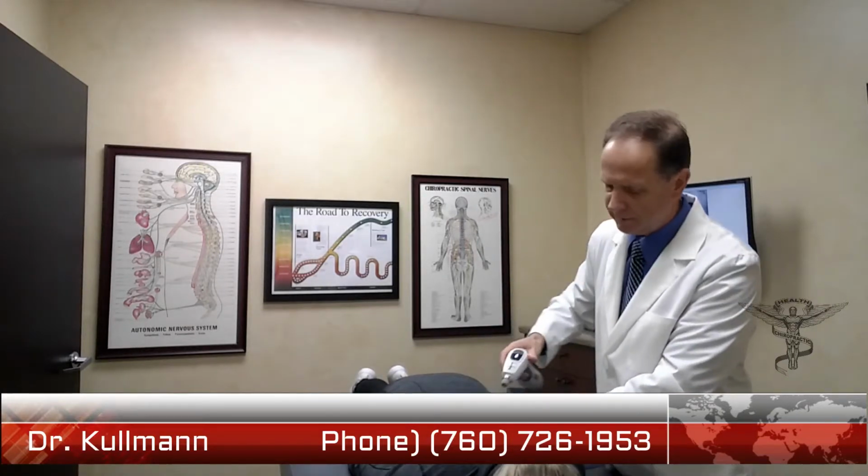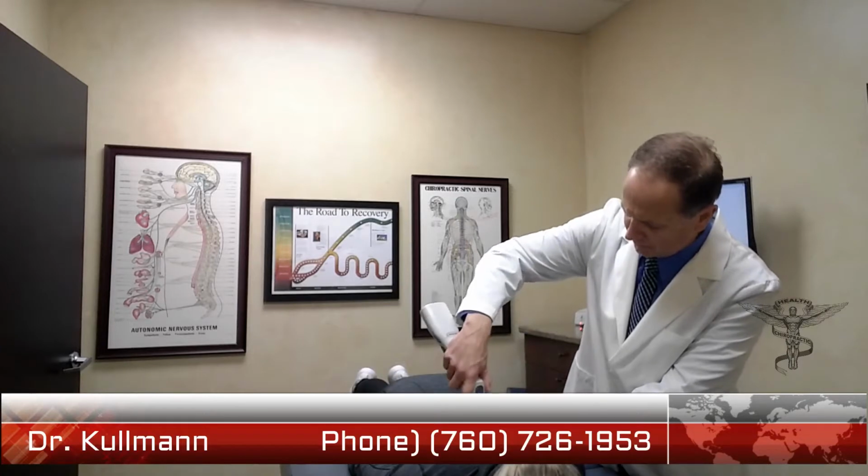Turn your head to the right. Lift your right shoulder up off the table and back down. Turn your head back to the center. So what we just did is a test a little bit higher on her mid-back, and that's the 4th thoracic vertebra. We're going to adjust that because we found one of those misalignments that are causing nerve interference in her spine. So we're going to go ahead and adjust that, and that might even be a little tender also. Is that correct, Tori? Yes.